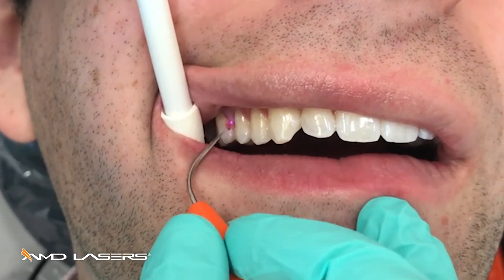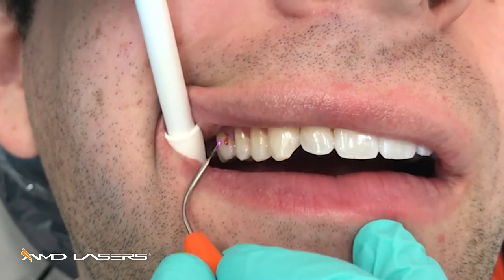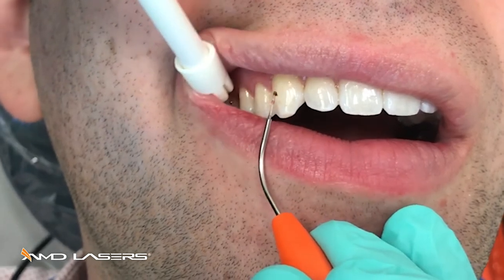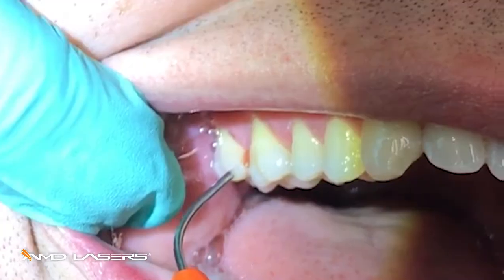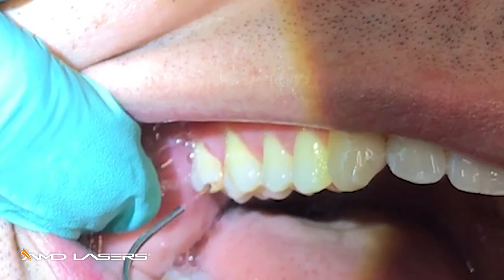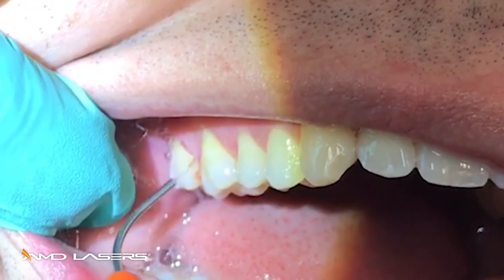That's your goal. This patient has no anesthetic whatsoever, because the tissue is dead — it doesn't hurt to remove it. See the little balls getting bigger and bigger. We're intentionally not using suction so you can see the slight laser plume that would be forming.